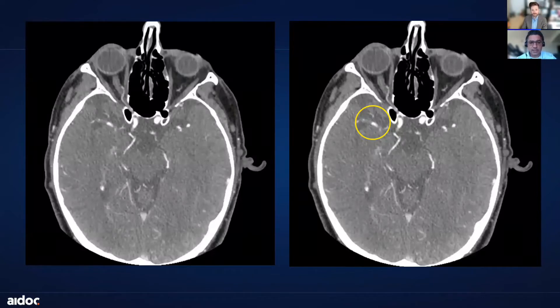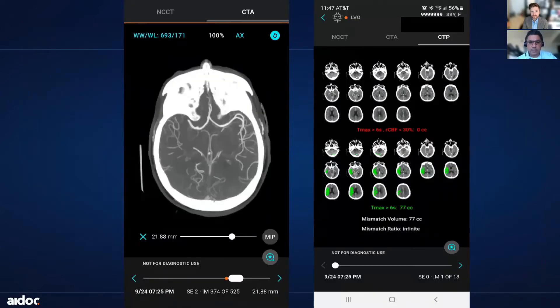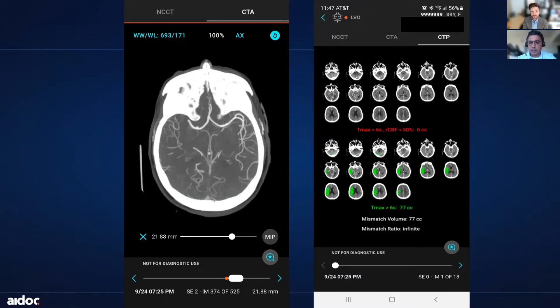The first case is a young lady that presented to the emergency room with a right hemispheric stroke on a Saturday. She had newly diagnosed atrial fibrillation. The module immediately identified an alert and notified the radiologist, which shows up in their desk workflow. Simultaneously, I get notified on my mobile app and I'm able to do a quick, immediate adjustment of the images to identify the right M1 occlusion, as you can see on the MIP images here. On the right-hand side, you can see the CT perfusion volumetric images that show a holohemispheric penumbra in the right hemisphere correlating to the MCA occlusion findings.